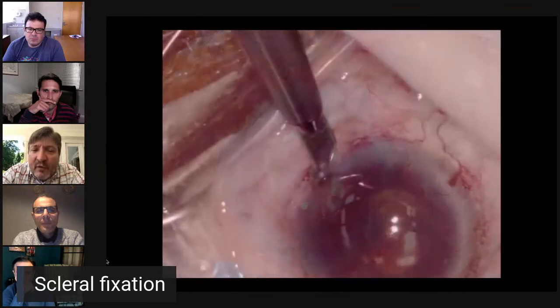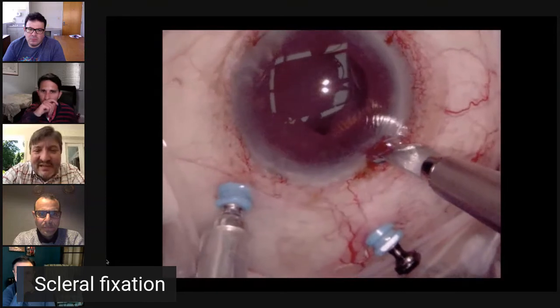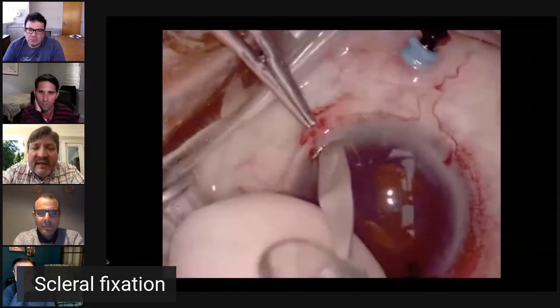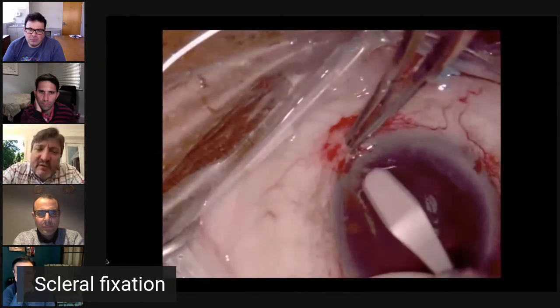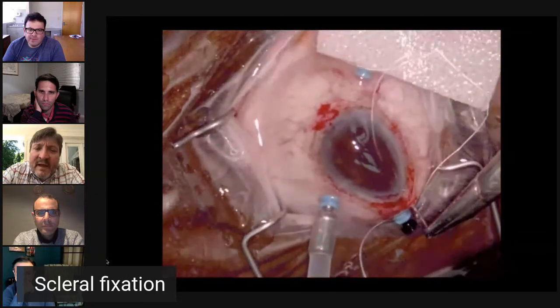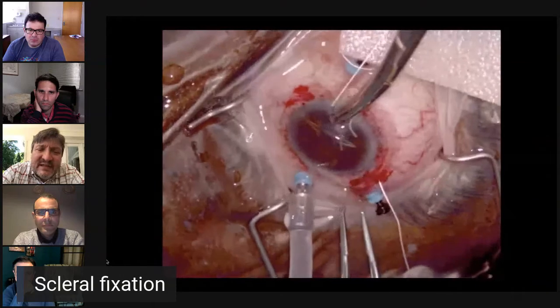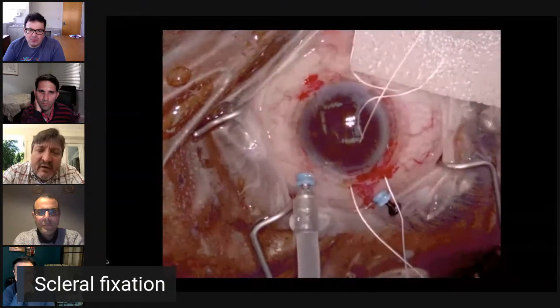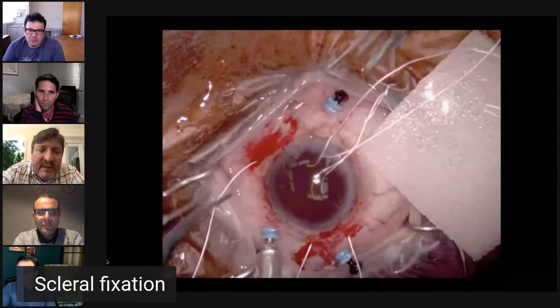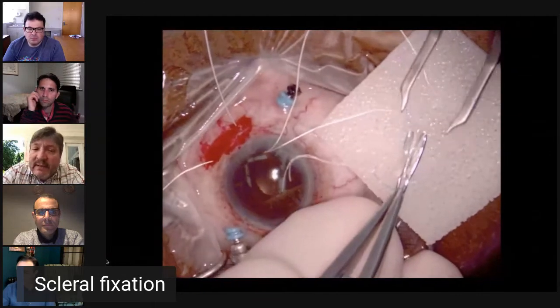I remove the IOL from the anterior chamber, and I'm making Hoffman pockets here because I really don't want this globe to be open for a very long period of time. So Hoffman pockets. I use a 550 blade to make the reverse bevel tunnel. The Gore-Tex needles are very blunt. They're actually vascular needles, so they're hard to pass through sclera. If I had to do this again, I would do a handshake with a needle.